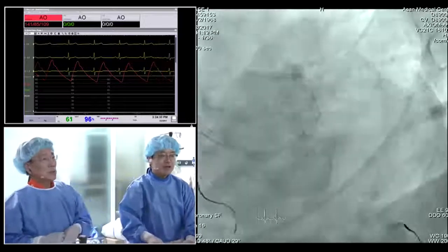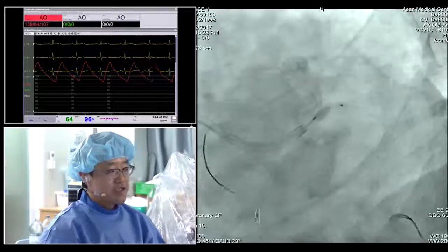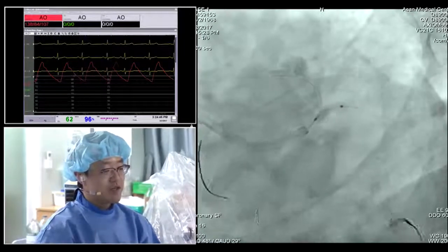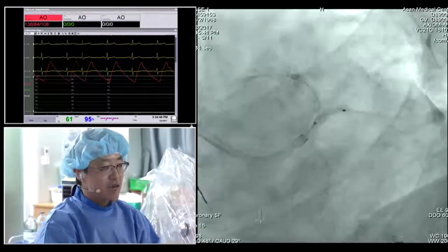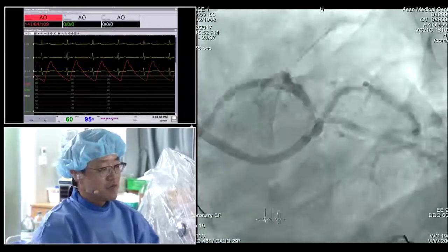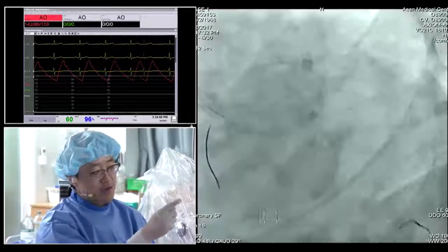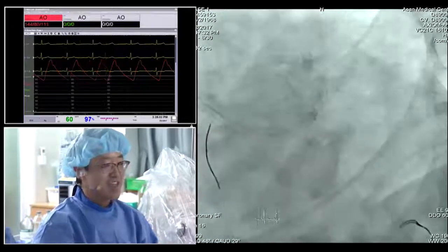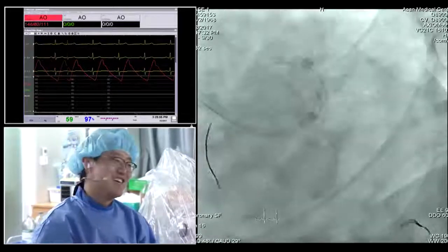So, what is next? Next, we did a balloon dilation with a 3.0 non-compliant balloon at high pressure. Next, there was some slight kinking and additional high pressure, and then dilation of the circumflex ostium. Next, the LAD ostium was much compromised, so we quickly moved on to stenting. To be honest, we could not wait. The patient had chest pain.